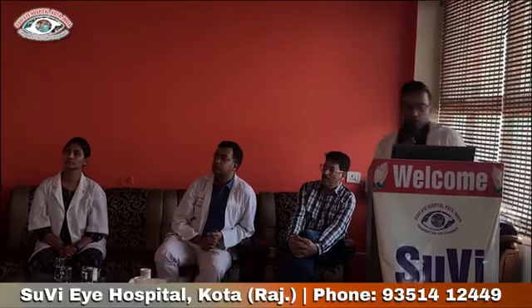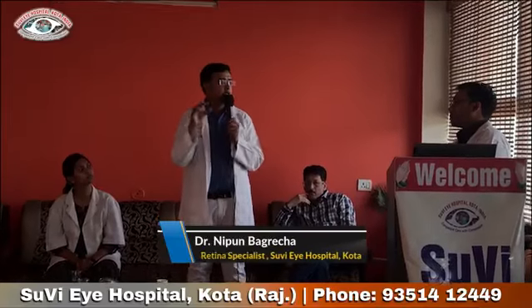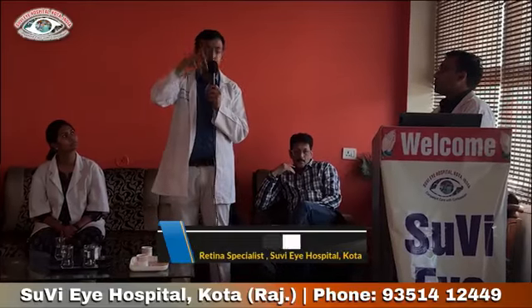Now coming to the barrage laser, indications usually are lattice degeneration, horseshoe tear, retinal dialysis, retinal holes. PRP topic was very nicely covered. The only thing is elevated NV, elevated fibrovascular traction. You should go away from the traction and the elevated NV, so that when the laser heals, the scar which will form will not cause traction onto the elevated NV, which can further predispose to more traction.